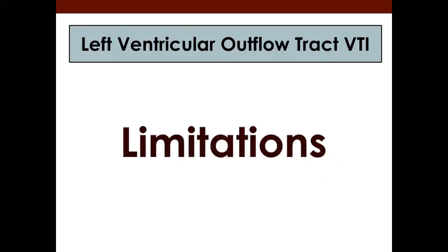That being said, LVOT-VTI has a number of limitations. Several of them have to do with cardiac function. If there's an arrhythmia going on, if the patient has valvulopathy, it's hard to interpret these results. But more importantly, I think for most of us, it's really, really difficult to do this study correctly. And if you do not do it correctly, you can come up with really incorrect results.